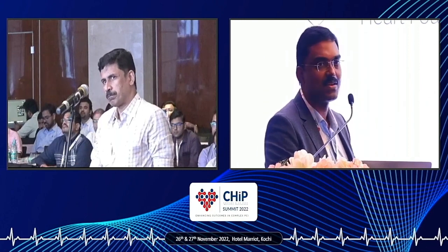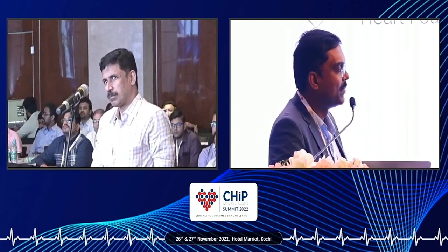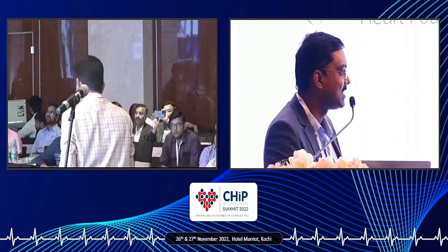No, it depends on the amount of calcium. Angiographically, if you see mild calcium, you can go with the laser. If it is severe calcium, you must go with the 1.25 burr. And generally, it may be an extra cautious step. Usually, I will do it with the Guidezilla, rather than getting trapped. If you go up front, you can tackle the complications.